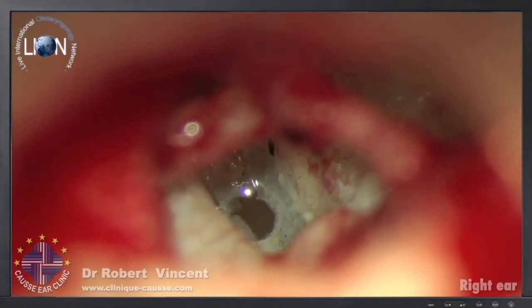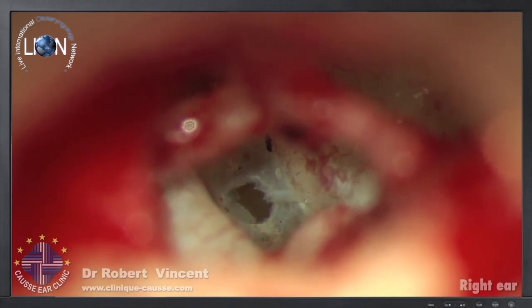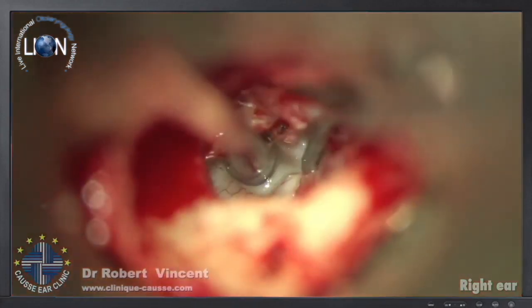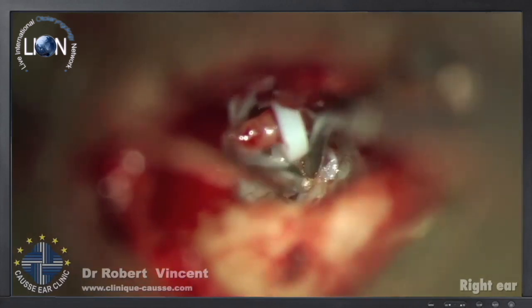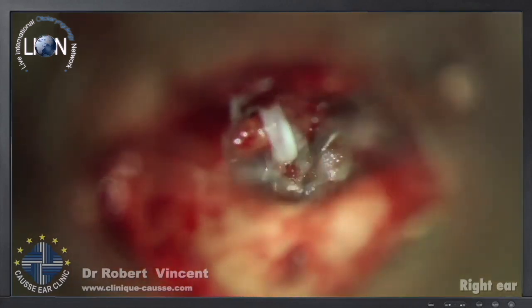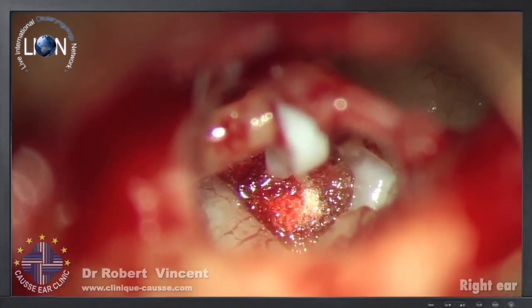This is not exactly a gusher. This is a high pressure, but not the real gusher, which is much more important than this. But I'm using a specific technique of the vein graft plus gelfoam to hold the vein down into the oval window, because when you have a gusher, it's pushing away the vein, and we have a floating vein. So the point is to try to maintain it like this by filling completely the oval window with gelfoam.